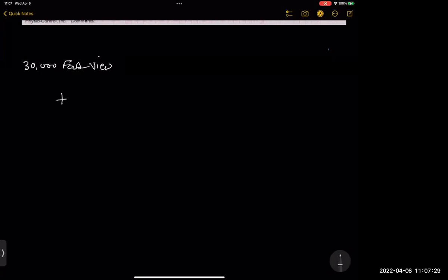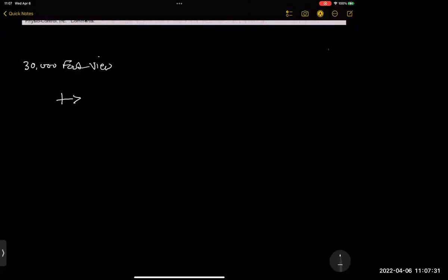And so the major take home point, there's a lot we can say about AVR, but the major take home point I want you all to know at this point is when you have elevation in AVR, this tends to be the result of global ischemia.